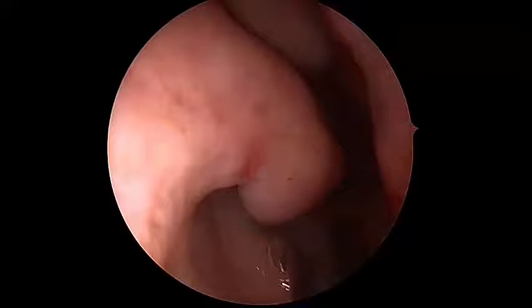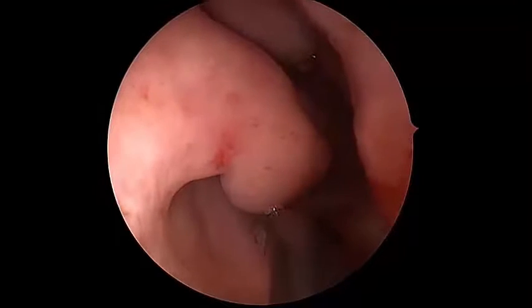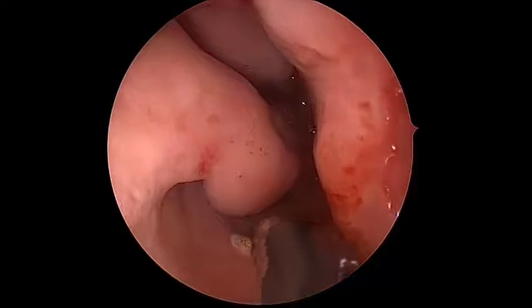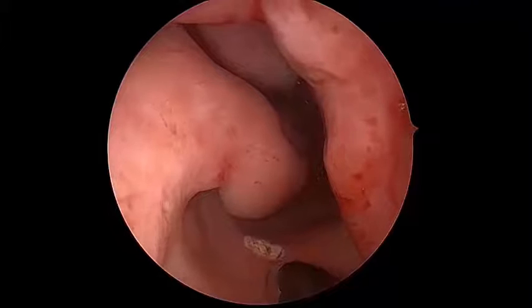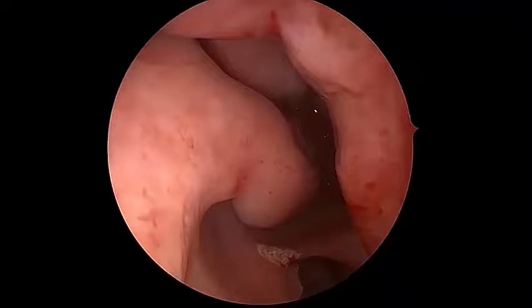You're going to see in a moment that it is substantially larger. I keep trying to coblate the edges and one edge keeps bleeding — I've learned over time to watch for that. Then just look at it, poke it a little bit and make sure it's not going to bleed. There it is, a little bit more to just the bottom right of the lesion, and it starts to bleed.